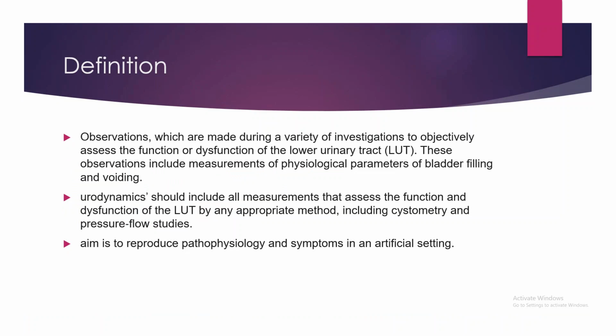So, what is the definition of urodynamics? These are the observations which are made during a variety of investigations to objectively assess the function or dysfunction of the lower urinary tract.